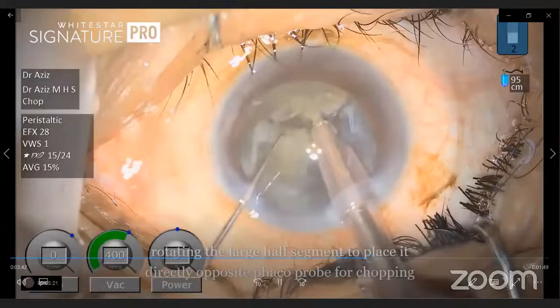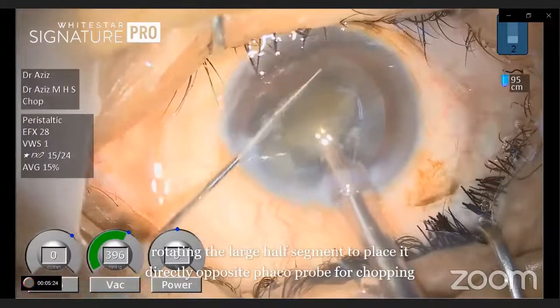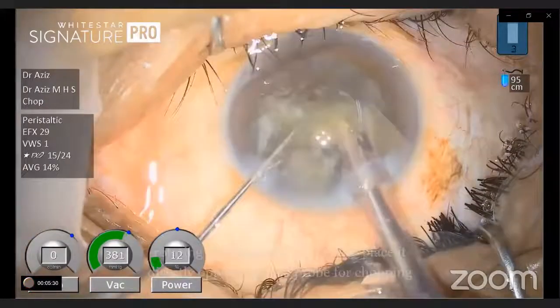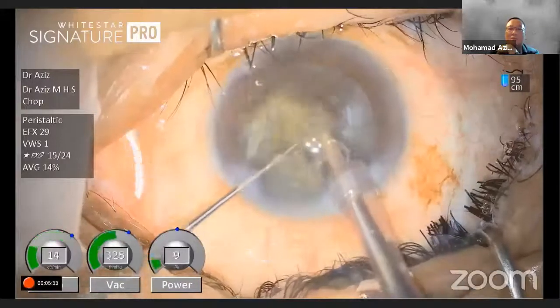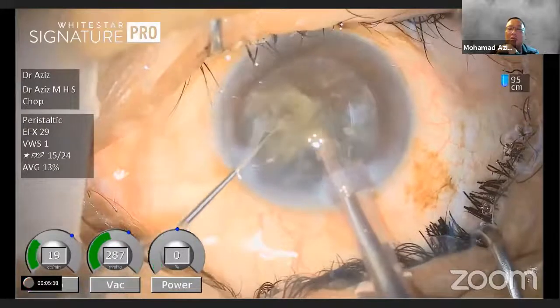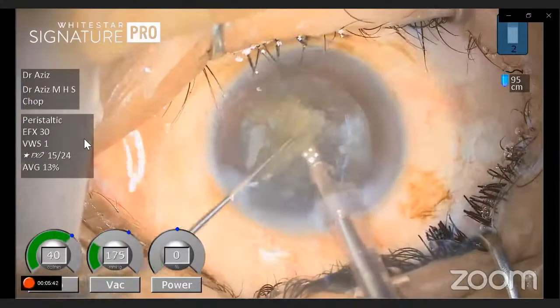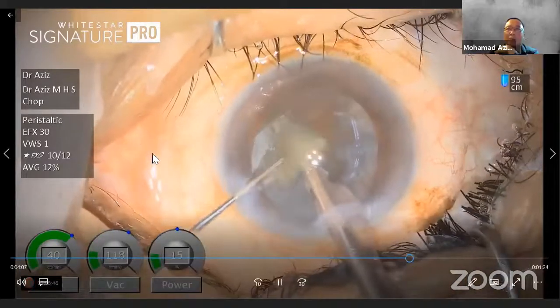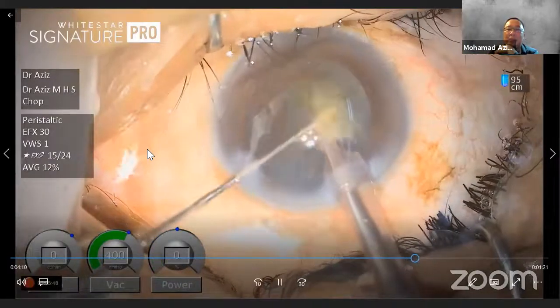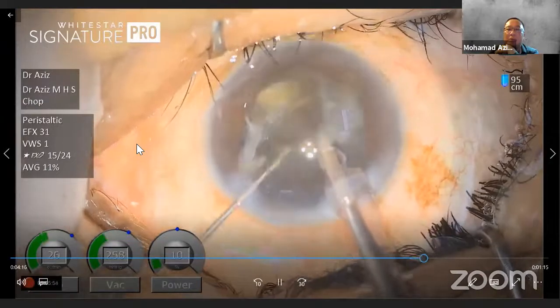Could it be that your setting has been tampered with? Because yesterday I didn't realize they changed my own setting. Then they said okay, and then said this is Dr. Ida's setting, which means Dr. Aziz's setting seems to have changed. Because last week we used it, Dr. Aziz needed to recheck the setting. Every time you start, you need to recheck your setting. You have to remember your setting. But this one is the polished or refined setting that we have done on this machine, MHS. I'm afraid this also changes. Once in a while we ask Priyan to recheck.